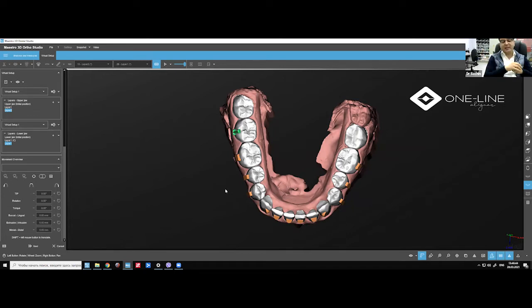Like, for example, Invisalign can do multiple movements, 3D movements together. Reason being because they use SmartTrack, which is a 3-layered sheet, which is more flexible. Or our friend from Malaysia, Ruben, he has his sheet TriStar, also a flexible sheet. I've tried that sheet also. But if you use tagless or other sheets which are hard, then you cannot plan multiple movements at the same time, because the sheet will not allow the multiple movement at the same time.